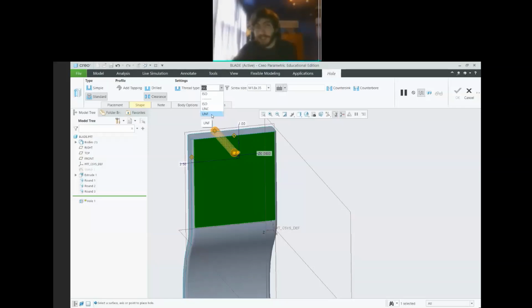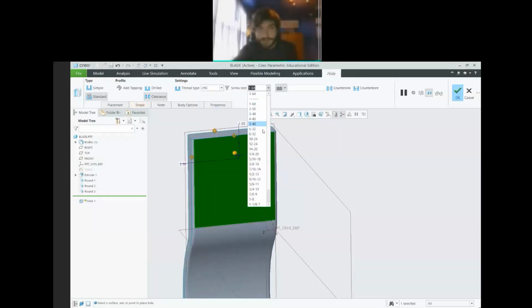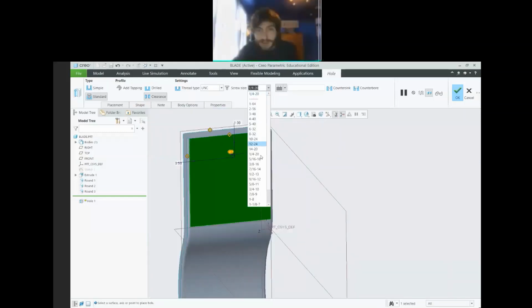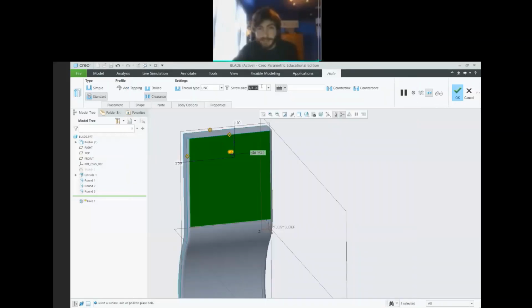So this is fine threads versus coarse threads. For each bolt size, there are 2 different thread types, right? One is going to have more densely packed threads. One is going to have coarser threads, right? We'll just do the coarse because that's sort of the default. Yeah, we'll do the standard, like 1/4-20 is fine.